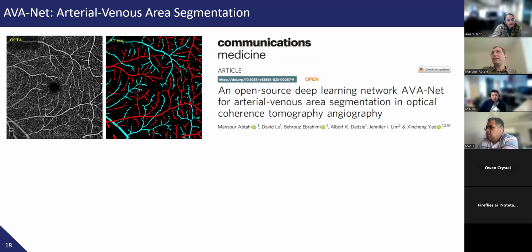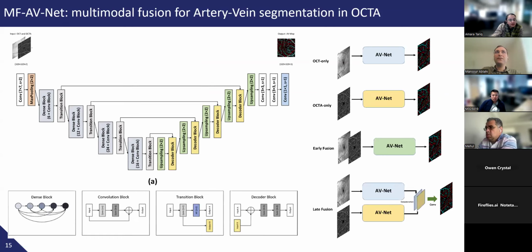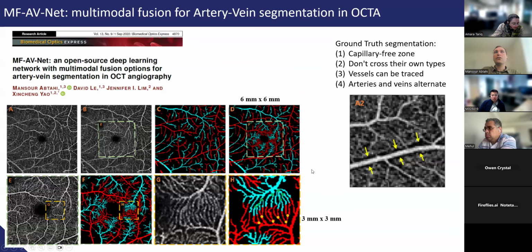For the segmentation of the arteries and veins? Yes, there were some models. One of them was UNet, which we had developed before in our lab, but the performance of the model wasn't so good. It could detect the arteries and veins, but the details of some small arterioles or capillaries weren't clear. We used a more accurate data set in this model, and we also developed a data set for the 3 by 3 data set.